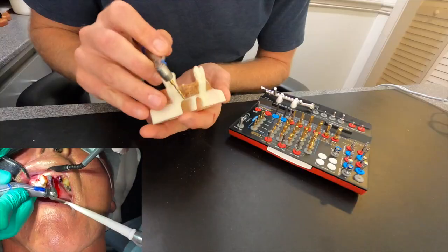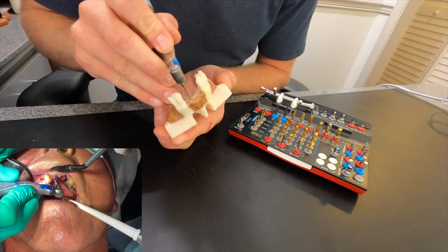Hey guys, welcome back to another episode of Teeth and Turbos. Today I'm going to be showing you how to place dental implants. If you can understand simple mechanics, or if you've ever tapped a hole into metal or placed a drywall screw like this, then you're going to fully understand how something like this is placed. It's very easy to understand the mechanics. This is why I really love implant dentistry — I grew up working on cars, working with my hands, and dentistry allows me to do all of that and help people at the same time.